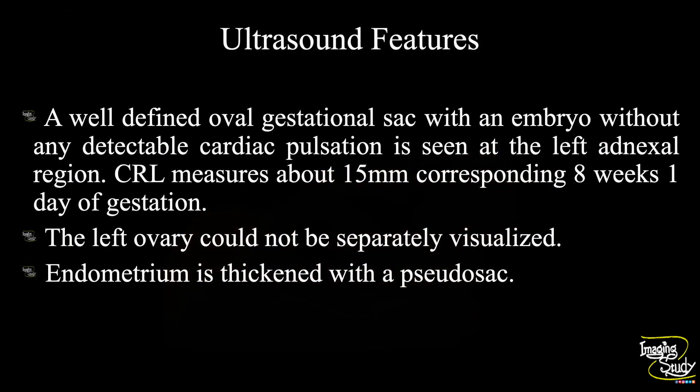In summary, a well-defined oval gestational sac with an embryo without detectable cardiac pulsation is seen at the left adnexal region. Crown-rump length measures about 15 millimeters, corresponding to eight weeks and one day of gestation. The left ovary could not be separately visualized. The uterine endometrium is thickened with a pseudo gestational sac. There was no peritoneal collection.